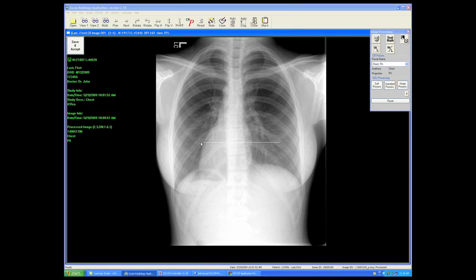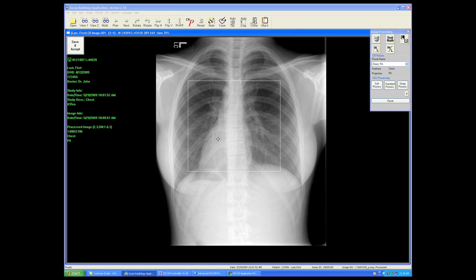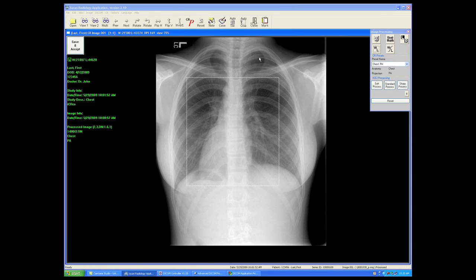This box will always drop in the center of your image and will always help get you close to an optimum window and level, provided you have positioned the anatomy well and placed it in the center of your field.